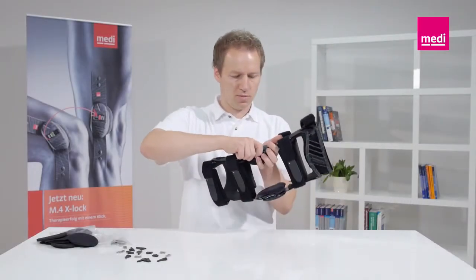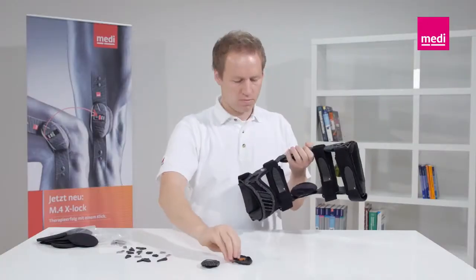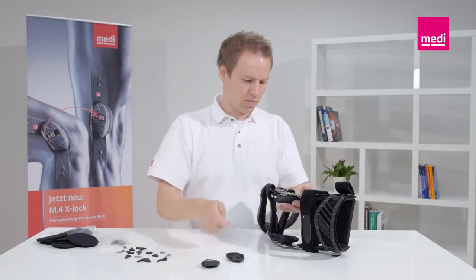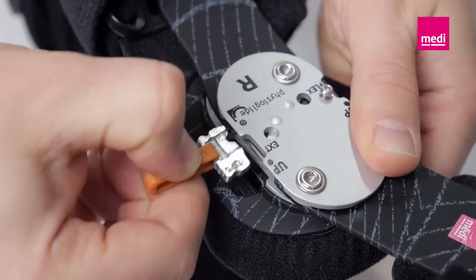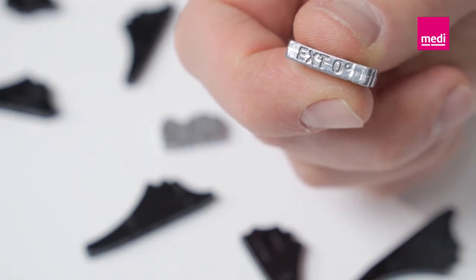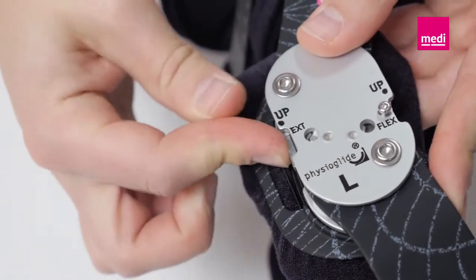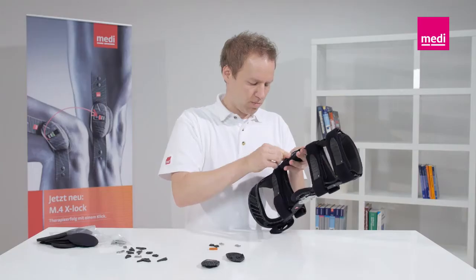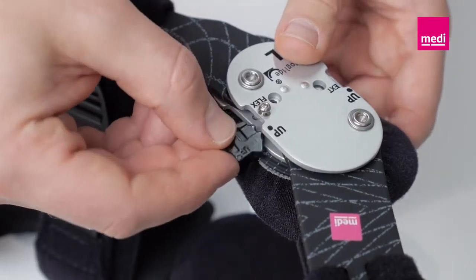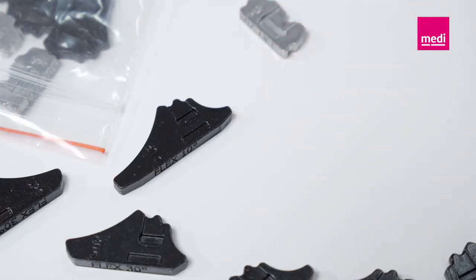To change the wedges, press the hinge cover at the back outwards to the side. Take the tweezers out of the hinge cover and use them to pull the wedges out of the hinge. All the wedges are marked with their respective settings in degrees for clear identification. Always slide the silver-coloured extension wedges into the hinge from the front and the black flexion wedges from the back, so the markings on the hinge and the wedge match. An audible click confirms that the wedge is locked in.